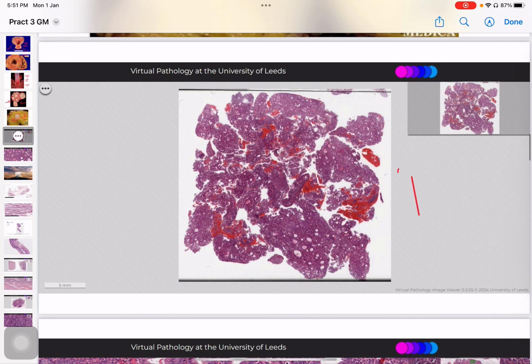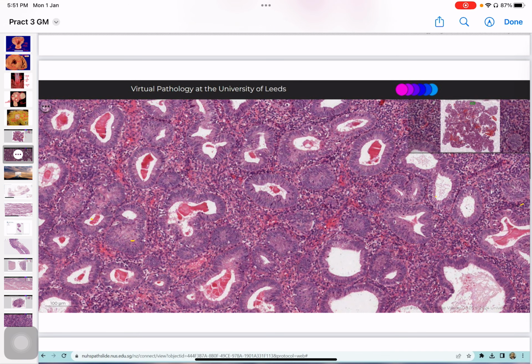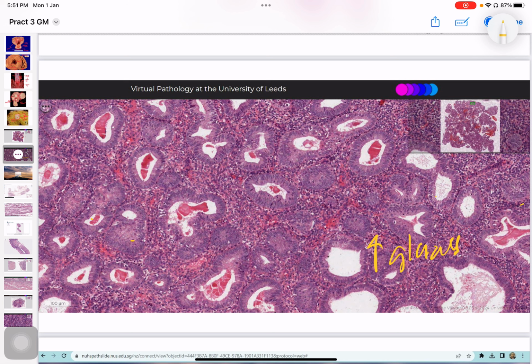and this endometrial tissue is abnormal because you can see there's a lot of glands. So there's an increase in gland number. And why is the gland number increased? Basically, you can see that there's an increase in cell number. So that's the reason why this is hyperplasia.